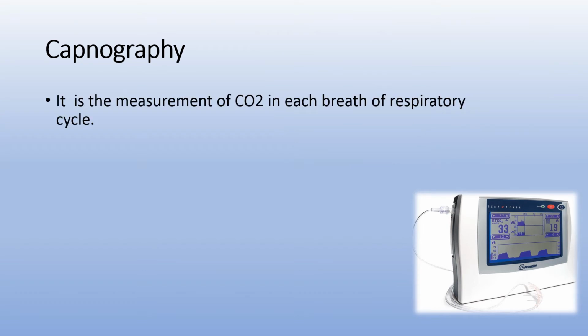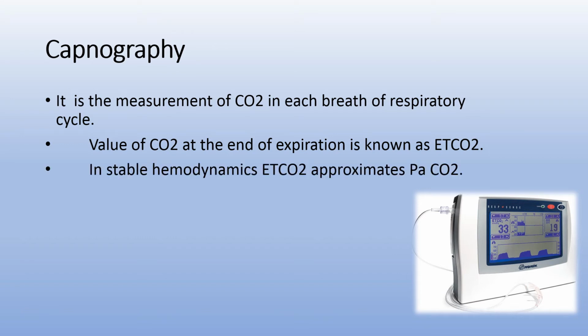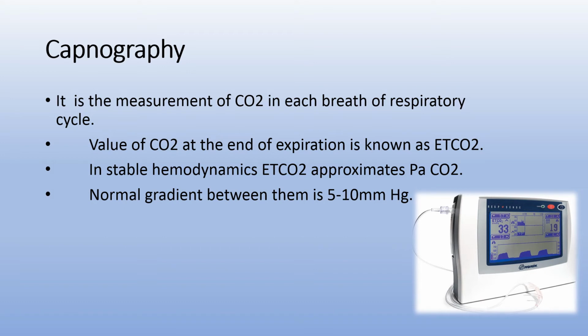Capnography is the measurement of carbon dioxide in each breath of the respiratory cycle. The value of carbon dioxide at the end of expiration is known as end-tidal carbon dioxide. In stable hemodynamics, end-tidal carbon dioxide approximates the PaCO2. The normal gradient between them is 5 to 10 mmHg.